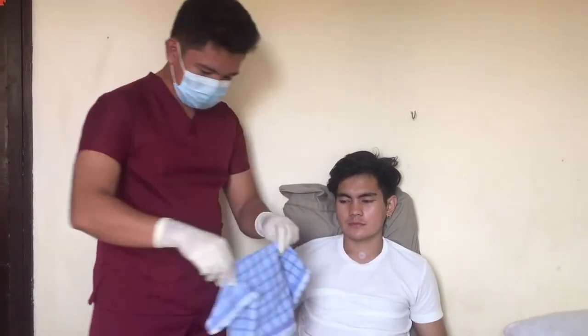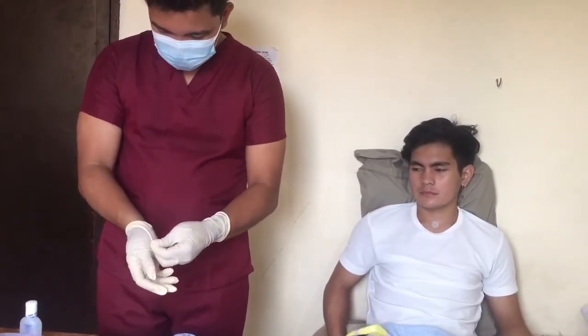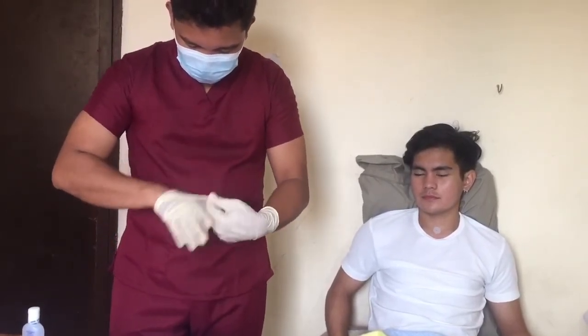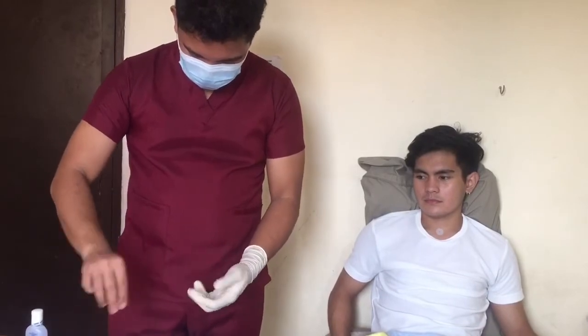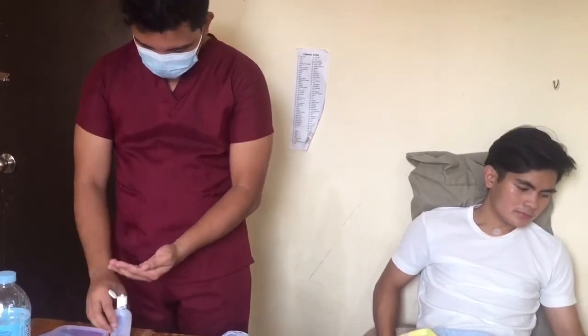Dispose of the catheter, gloves, water, and waste container. Wrap the catheter around your sterile gloved hand and hold the catheter as the glove is removed over it for disposal. Wash hands or sanitize by using alcohol. Ask the client if he is comfortable in his breathing.